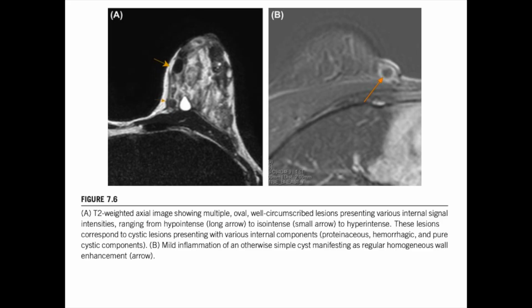If that's where most unnecessary biopsies come from, that sort of BIRADS 4 zone, doesn't it kind of wreck the utility of kinetics? It's an excellent point. I mean, if you have a benign-looking lesion but it has a plateau, do you still have to biopsy just because of that kinetic ambiguity? And that is the immense difficulty of the job. You are often forced to consider it, yes, because the kinetics failed to definitively rule out malignancy.